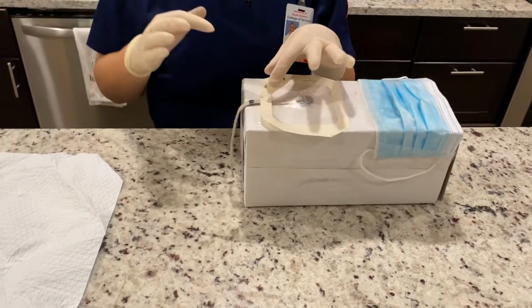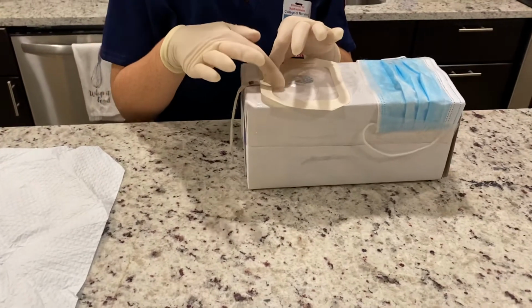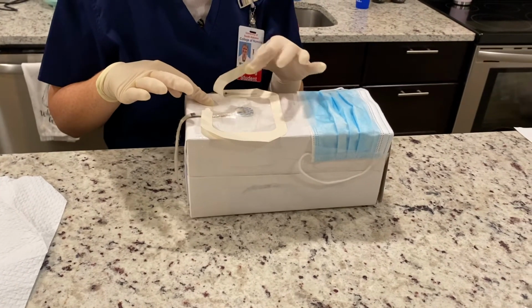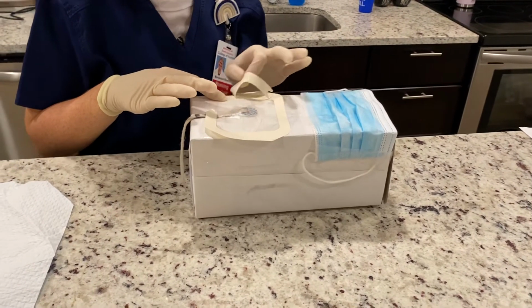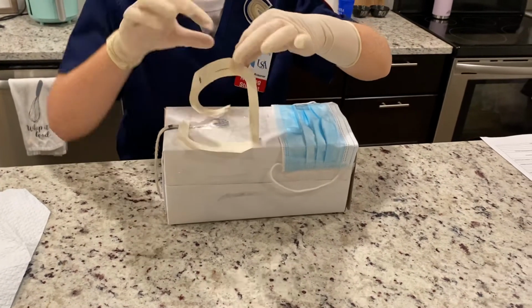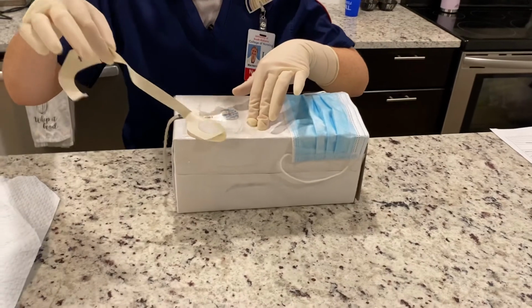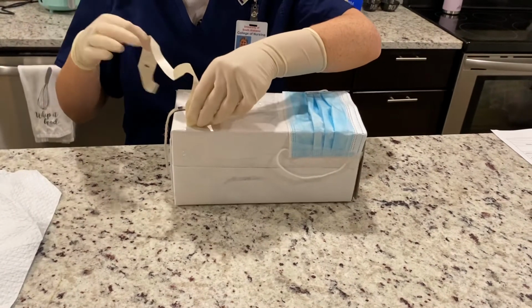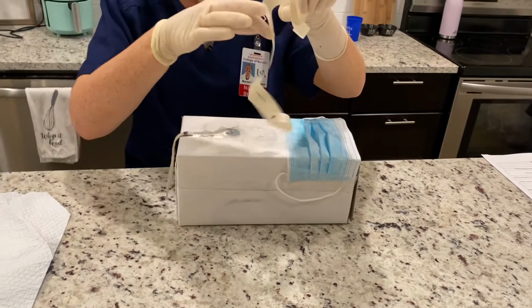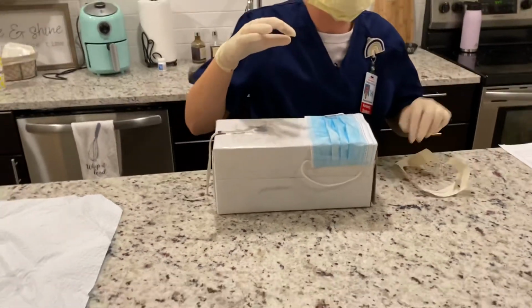Then I'll remove the paper surrounding the edges, and I'm going to save it for the label. I'm going to put this to the side for the label.